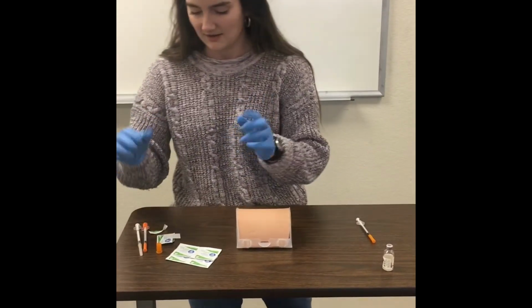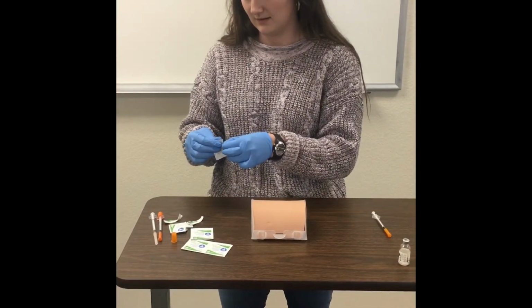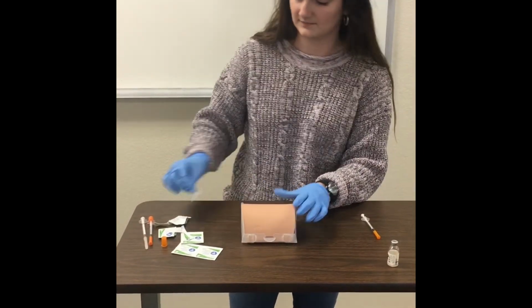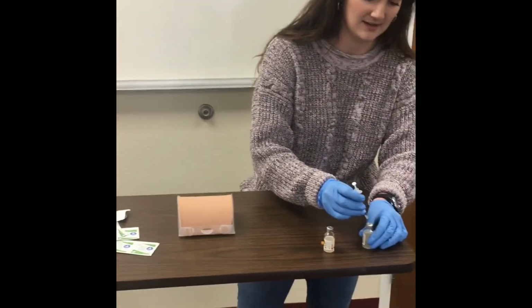With our gloves on after we wash our hands, we're going to get an alcohol prep pad and clean the site. We're going to dry that off, and for this purpose I'm going to inject this back into the cloudy.